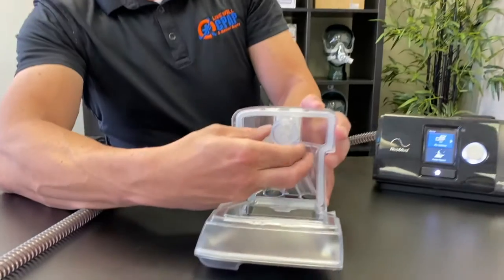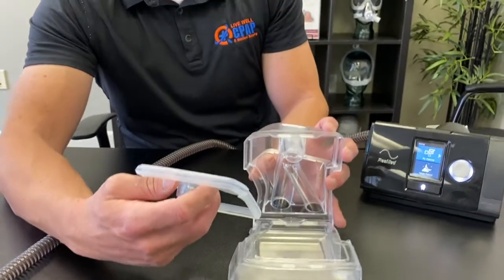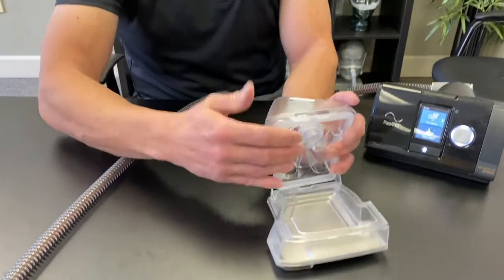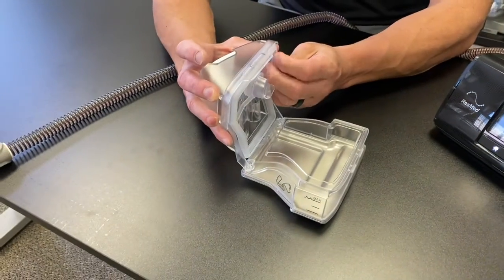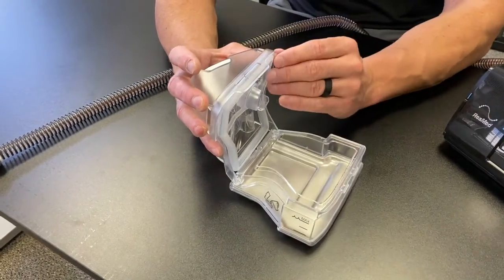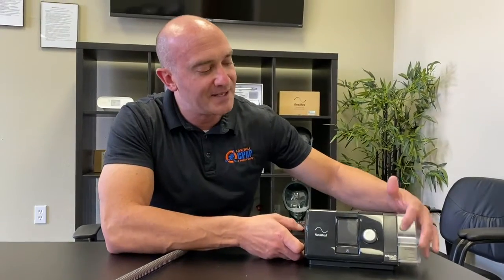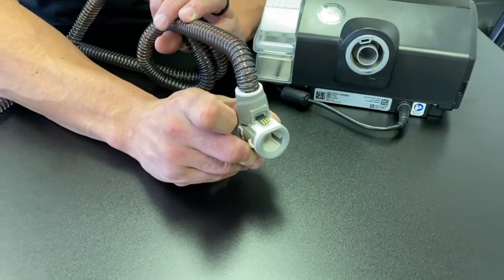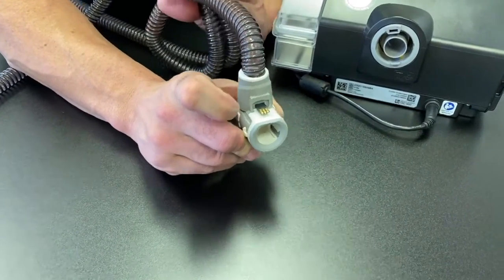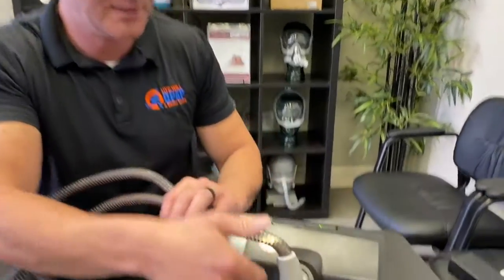Wash the humidifier chamber once a week. The baffle will come off right here — wash it with warm soapy water. The manufacturer recommends a mild detergent, usually liquid dish soap. Stay away from antibacterial soap because it will ruin this silicone piece, which is important for the seal and air circulation. When you push the humidifier back in, make sure it goes all the way in with no gap. If there's a gap, it will sound like it's leaking — give it a good push and it'll snap in.